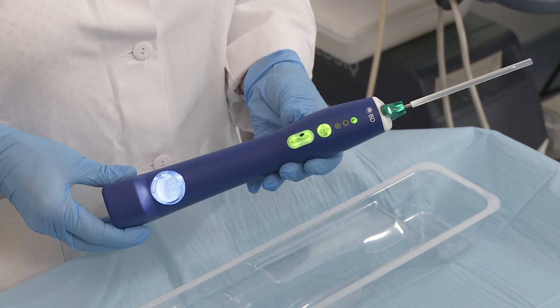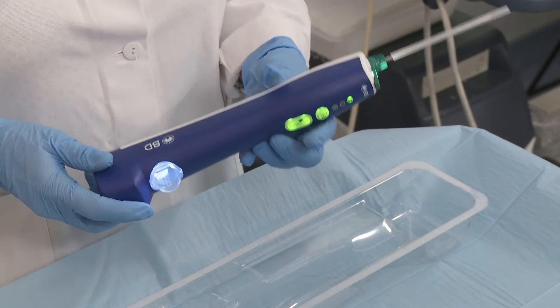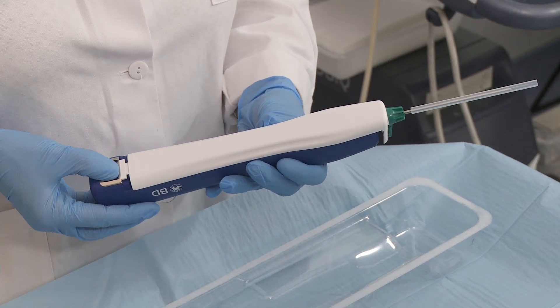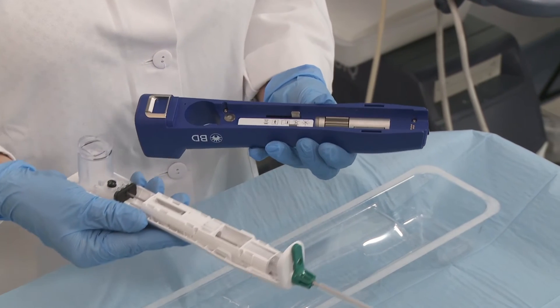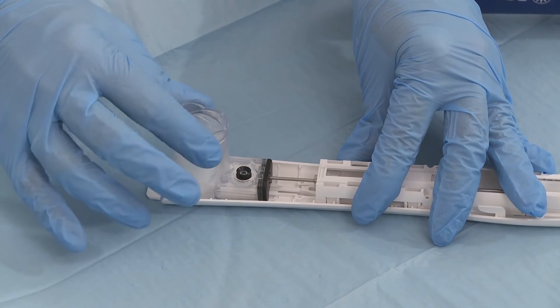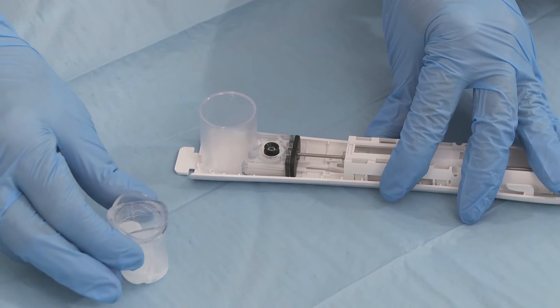Option 2: Keep the sample container in place. Remove the probe from the driver by pressing down on the locking tab, sliding the probe cover completely forward, then pulling the probe straight up from the driver. Then turn the sample container counterclockwise to detach it from the probe.